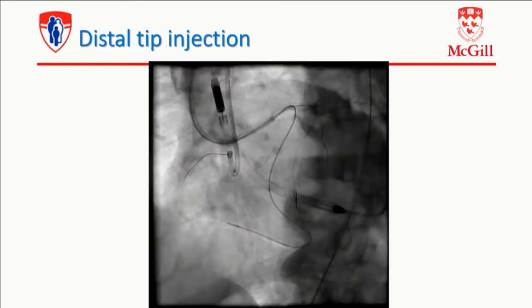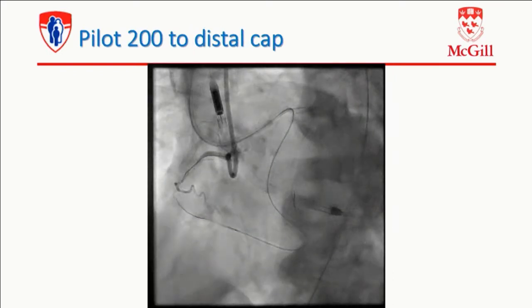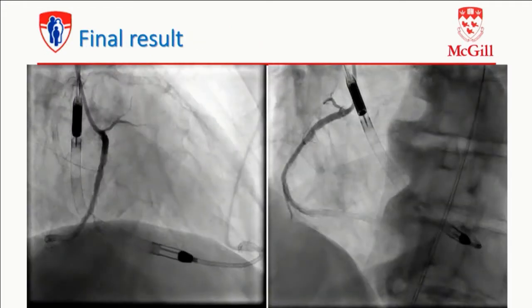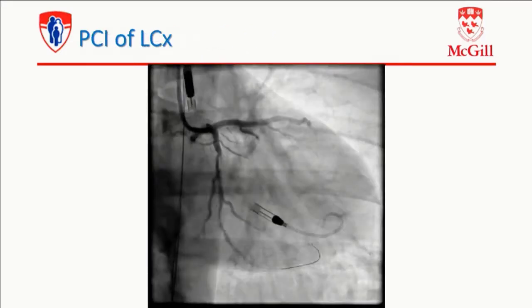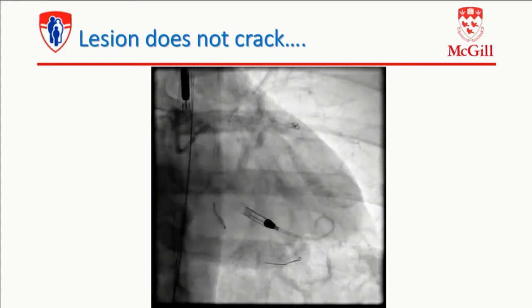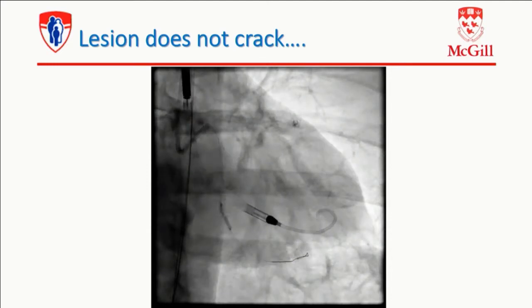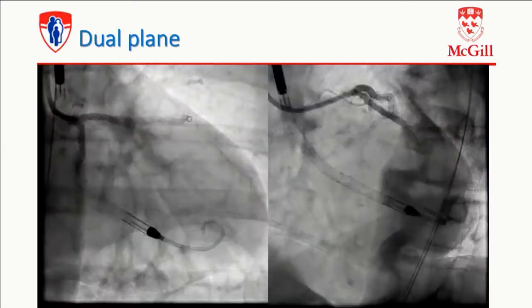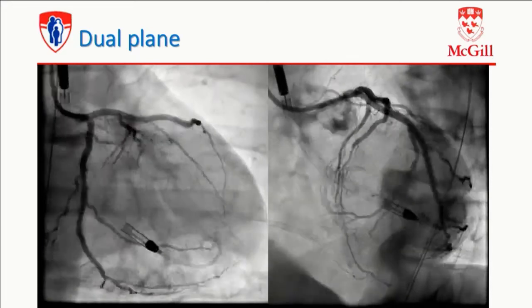Did that, got retrograde during the same procedure because we attempted antegrade and did not cross. And finally, we were able to do a true-to-true crossing, retrograde, got into a Guideliner, finally opened up the right, and then finished up the work on the LAD. And then we say, okay, it's too complex, finish the circ, but if you have one lesion that doesn't crack, there's got to be another one in this coronary tree that won't crack anymore. So we have rota, we finished up with rota, and finally, this is done. So this guy had 1 femoral access and 2 radials. They were 7 French. So that's feasible, even in CHIP.